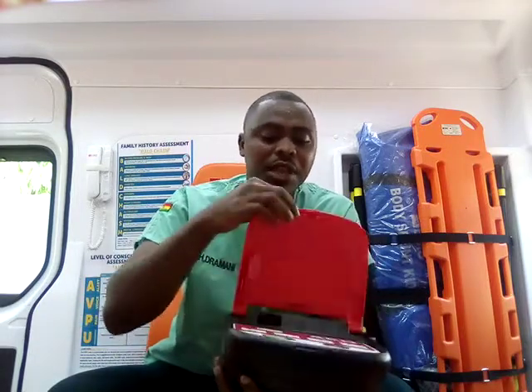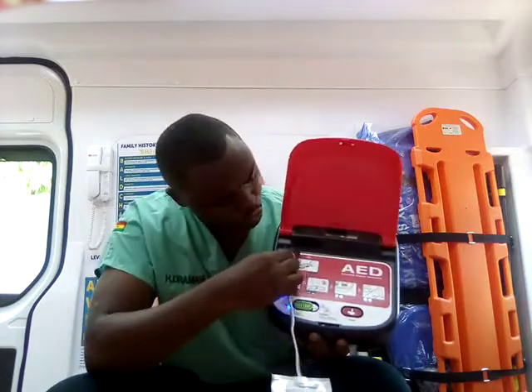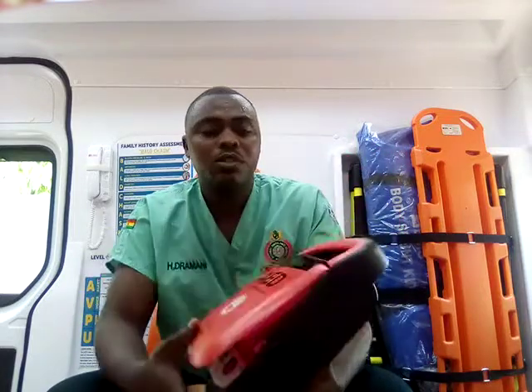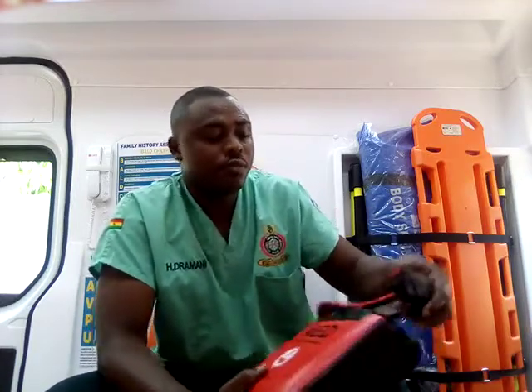It tells you plug in pad firmly. So it turns on, and you realize that it has 5 steps you are supposed to follow. Plug in pads. Insert connector firmly. You connect it here. It says adult pads. Remove clothes from the patient's chest. Place pad exactly as shown in the picture. Press pads firmly to the patient's bare chest.